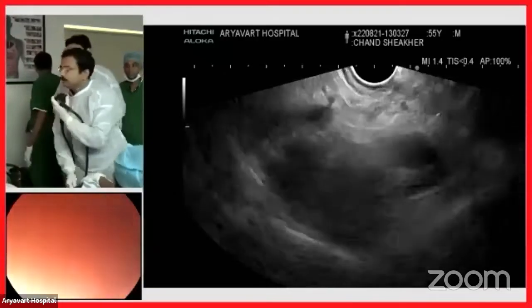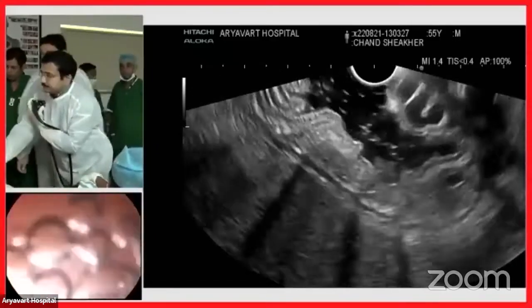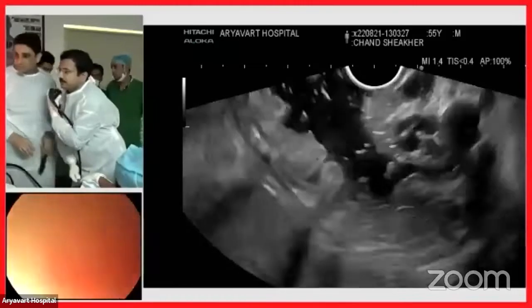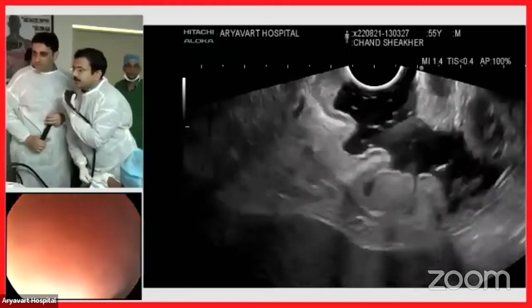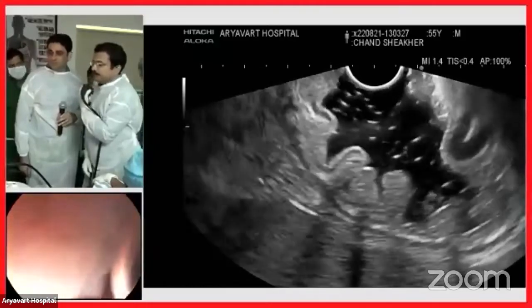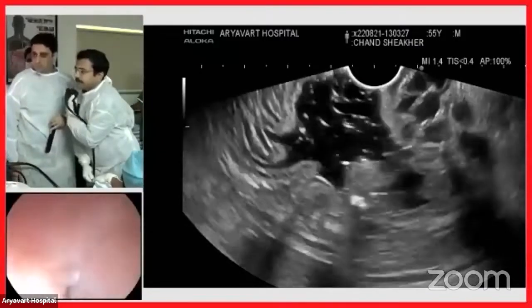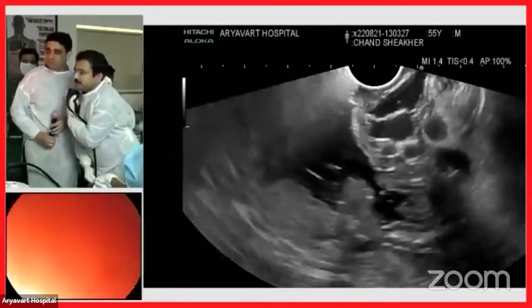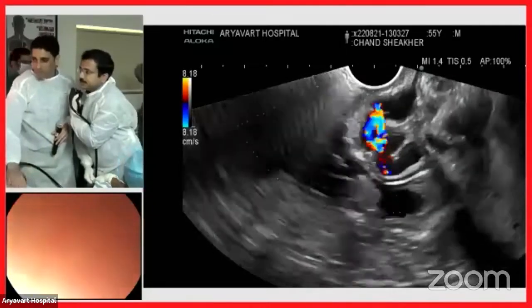We are now trying to locate the varices. Dr. Kapil is with me and going to help with this procedure. The steps for US-guided glue and coiling of varices: first, we instill water into the fundus — which we have already done — and this gives much better acoustic coupling for the varices to be visualized. These are the intramucosal part of the varices. Can you give the flow Doppler please?